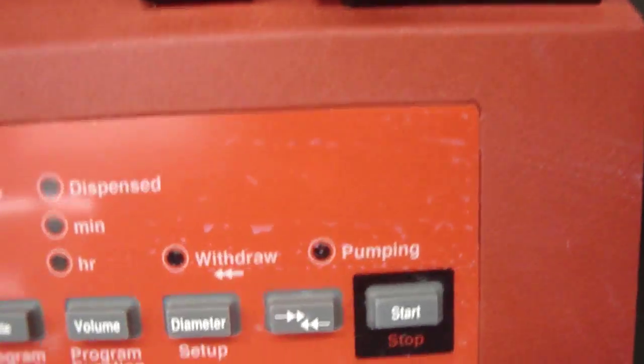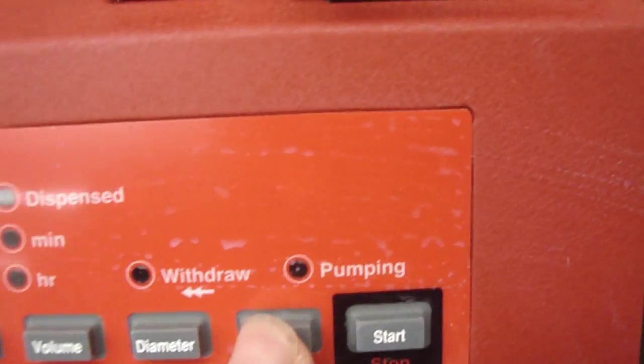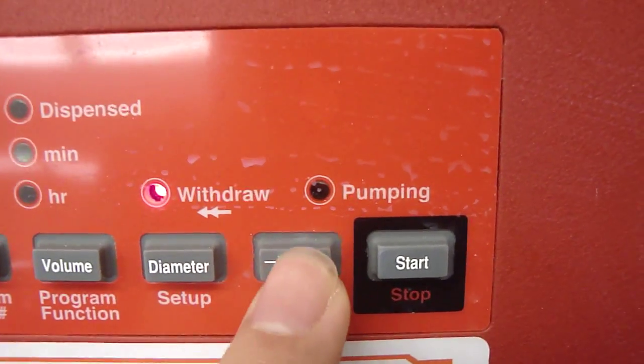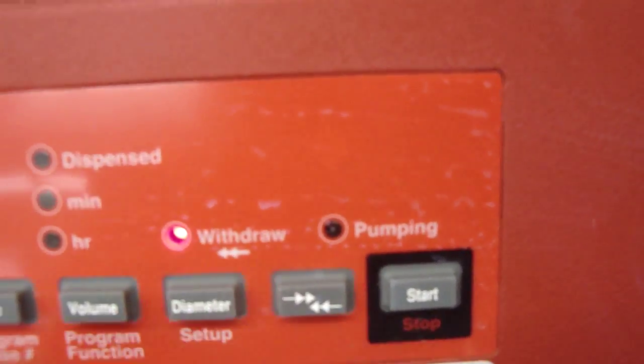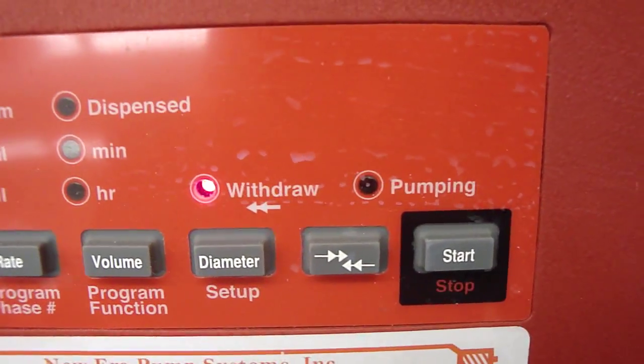And the last thing you can change is the flow direction. By pressing this button, you can change the flow direction from pumping to withdraw or vice versa.